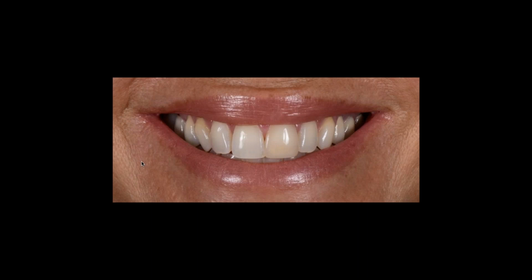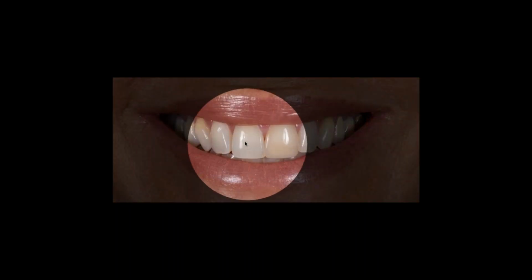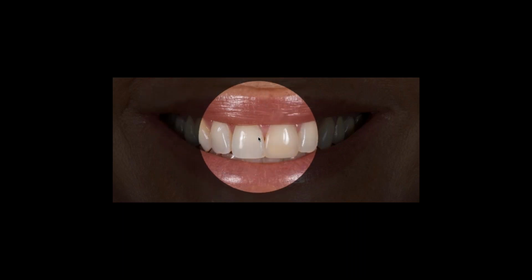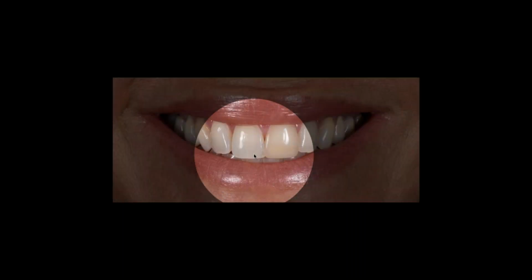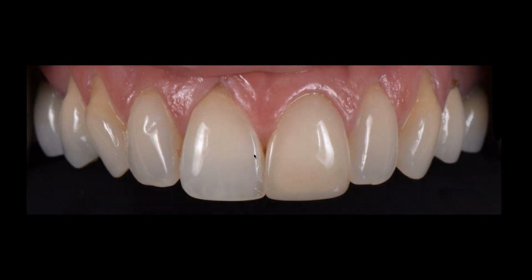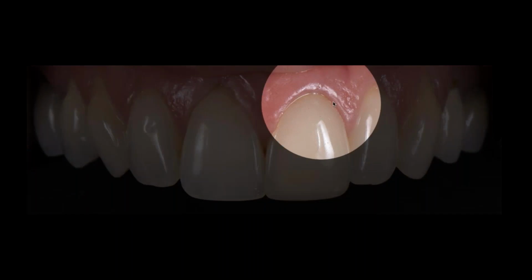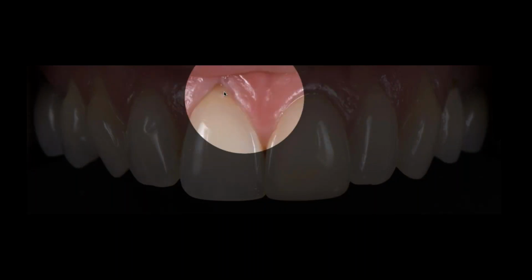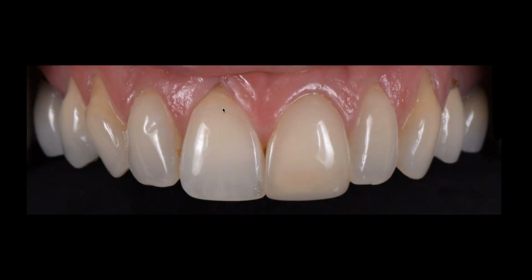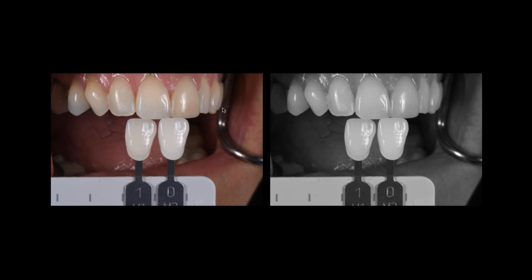And sometimes when I'm working through my shades, it's a lot simpler than all the things I just told you. Our only job in a case like this is to do what? To make that match. I don't see gingiva, but the papilla looks pretty good. All the rest of the teeth are what they are. So really all I have to do is try to match what I see in nature. Could this patient use a little crown lengthening? Maybe. Really, they probably need a graft here, right? To close this off and protect the tooth. But the patient doesn't show that, so it's not as much of an issue for us.